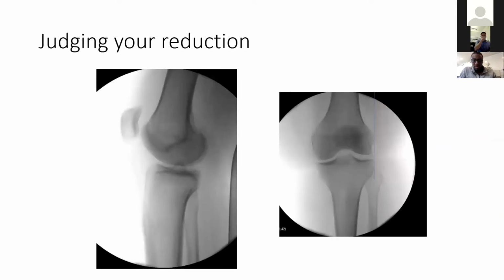This is an important concept about getting perfect fluoroscopic images. Alex, what can I do to my lateral image there to make it better? Yeah, so if I'm looking at your lateral image, you generally want some overlap between your fibula and your tibia.